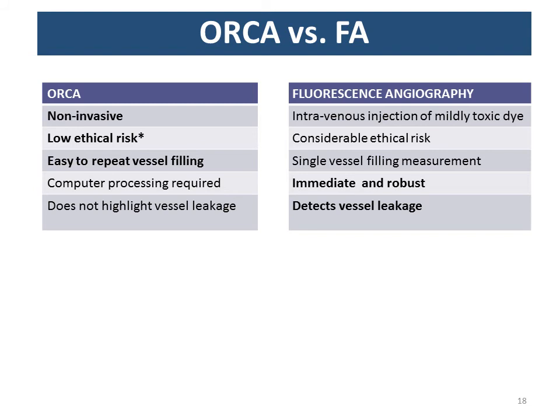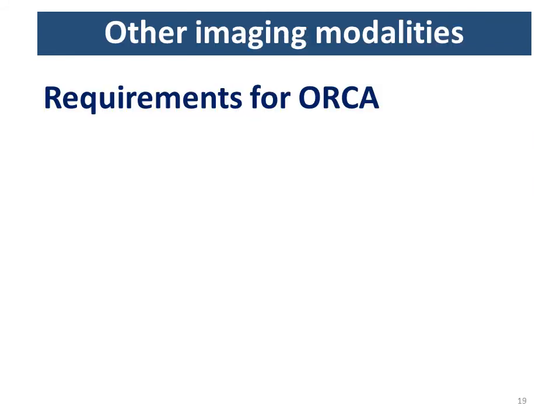Of course, this oximetric ratio contrast angiography requires computer processing, which fluorescence angiography doesn't necessarily require. And the thing is that we don't think ORCA would highlight vessel leakage, which is a big strength of fluorescence angiography, looking at microhemorrhages and seeing blood plasma leak out.